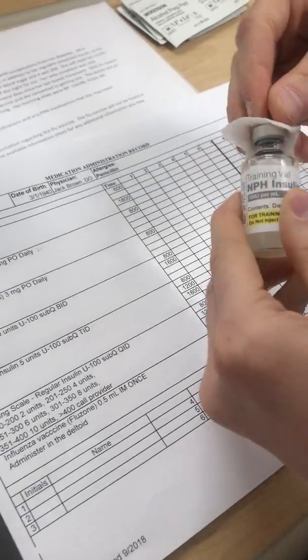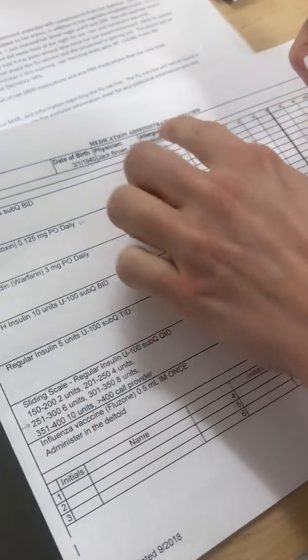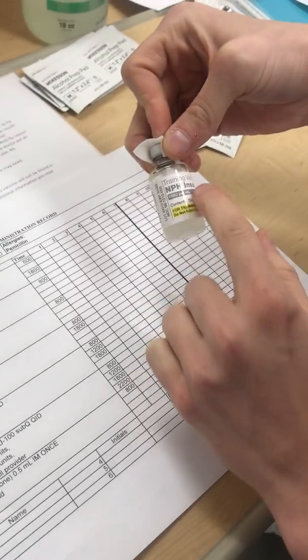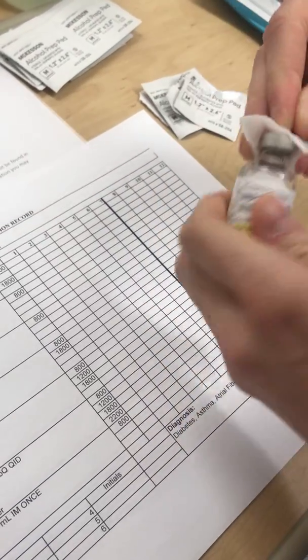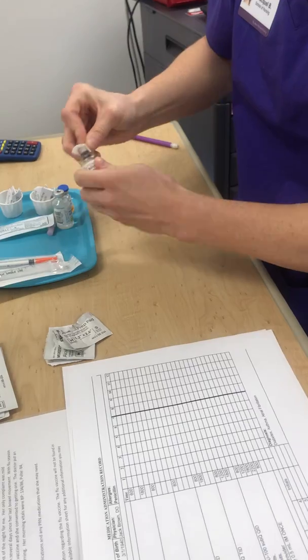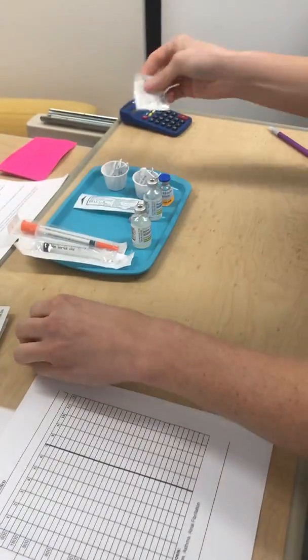And then I'm going to make sure that it matches up here. Doing another safety check. So my NPH insulin 10 units, U100 sub-Q BID 8 a.m., allergy penicillin, and then I have the right patient, and then NPH insulin 100 per mil, not expired. That all looks good. Did that one for 20 seconds there. Super clean, and I rolled it as well.